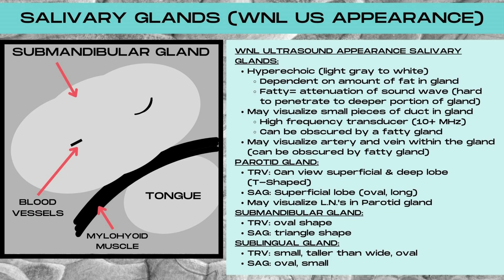The normal ultrasound appearance of the three major salivary glands is going to be a hyperechoic echo texture, ranging from a light gray color to white, and this is dependent on the amount of fat in the glands. The fattier the gland, there's going to be more attenuation of the sound waves, making it harder to penetrate to deeper portions. This is very similar to what happens in a fatty liver on ultrasound, so it may require decreasing the frequency in order to penetrate deeper into the glands.